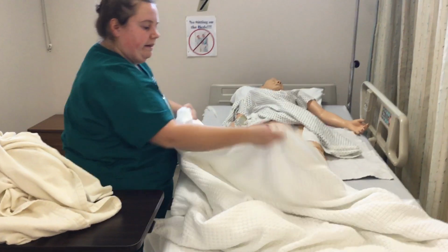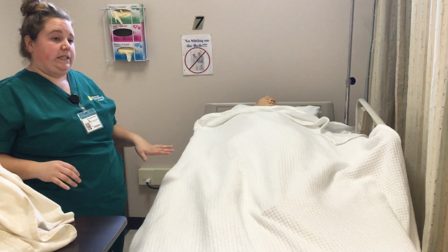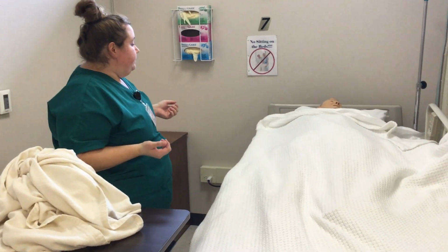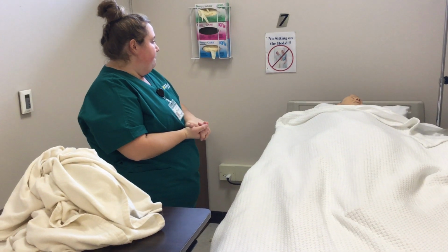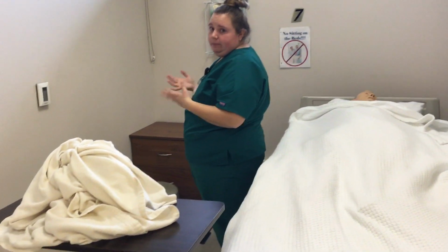Making sure that I brought the bed back to the lowest level, gave the patient their call light, and replaced the side rails if they were used. I got some drips on the catheter. I would perform hand hygiene again and put new gloves on.